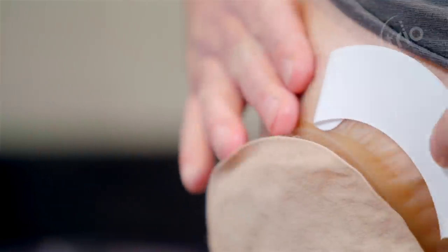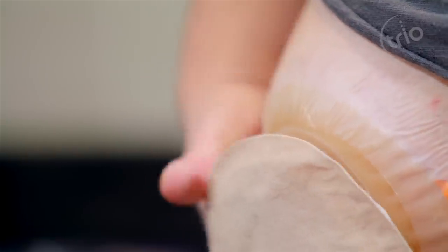Trio Silics is ultra thin, waterproof and non-absorbent, which makes it perfect for swimming and allows your skin to breathe.